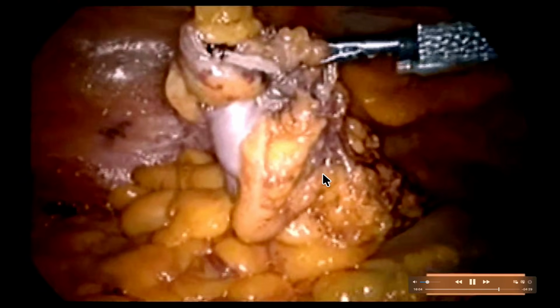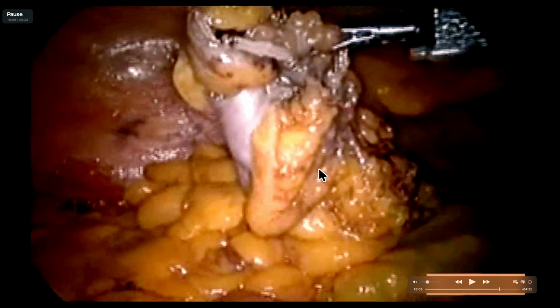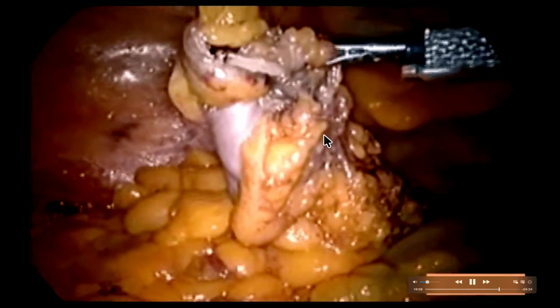Now open surgery starts. This is all about laparoscopy, what you have to do. You make a mesosigmoid medial window, and then keep on doing medial mobilization, lateral mobilization, and transect the rectosigmoid junction. And after that, mobilize it up to the transverse colon, and now open surgery. So let us see how to do open.